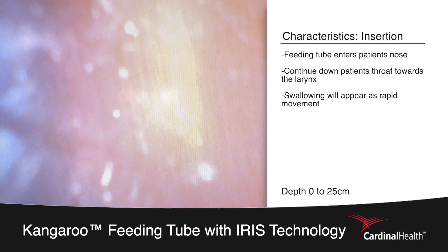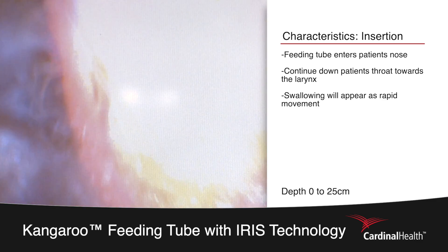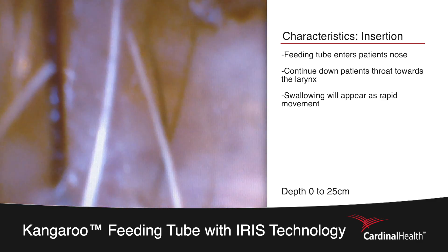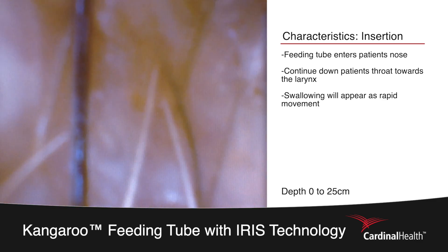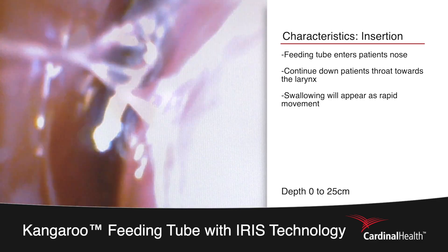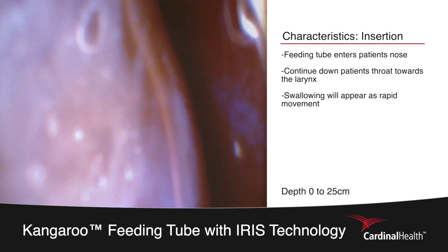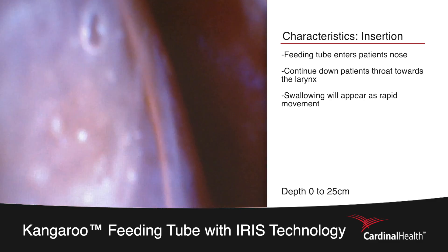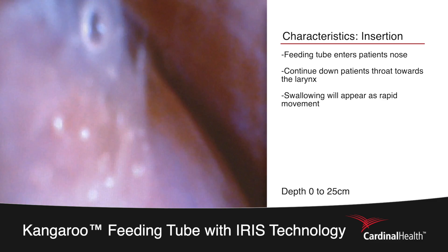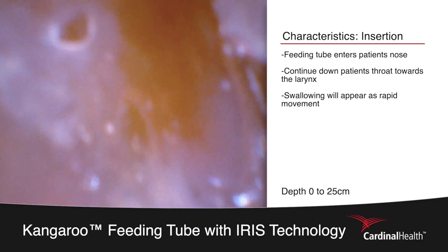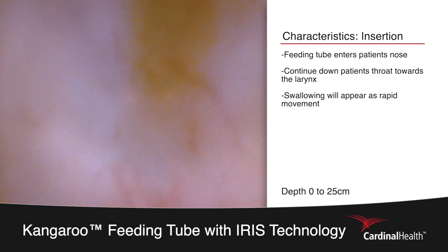The procedure begins with the placer inserting the feeding tube into the patient's nose, as can be seen here by the nasal hairs. The tube will then progress down the back of the patient's throat heading towards the larynx. The patient is swallowing, so we'll see some rapid movement and will quickly progress down into the esophagus.